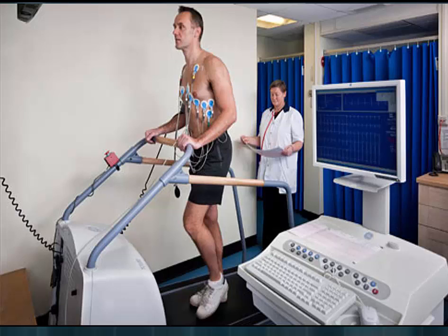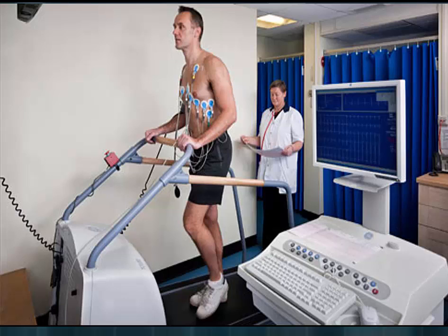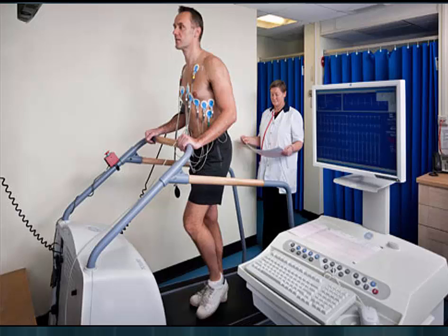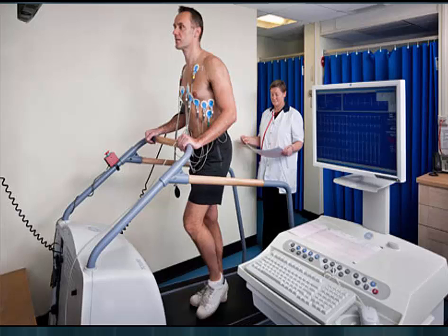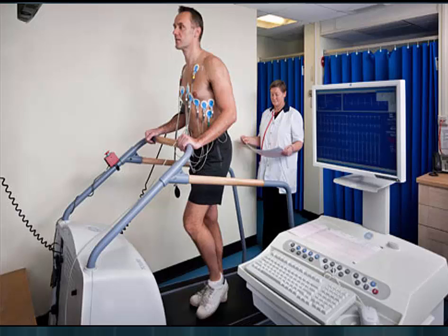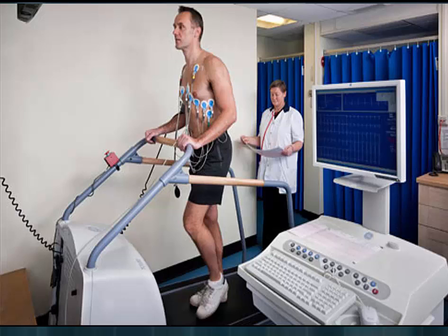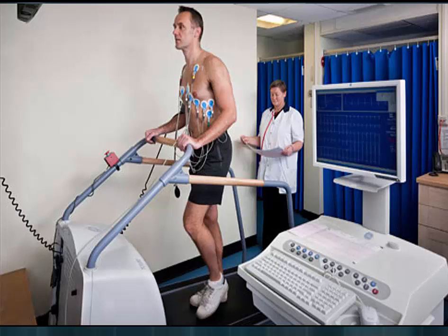Exercise tolerance tests, also known as a stress test, gather information about how the heart works during physical activity. Because exercise makes the heart pump harder and faster than usual, an exercise stress test can reveal problems within the heart that might not be noticeable otherwise. It usually involves walking on a treadmill or riding a stationary bike while heart rhythm, blood pressure, and breathing are monitored. The test is recommended if coronary artery disease or an irregular arrhythmia is suspected, and may also guide treatment for those already diagnosed with a heart condition.